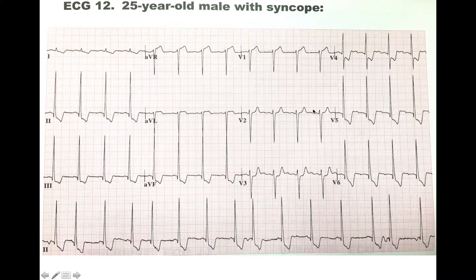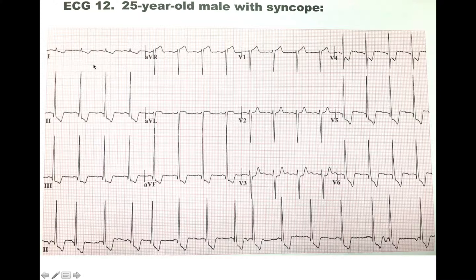So this EKG is leading us toward the idea that this patient has left ventricular hypertrophy. Another common finding in LVH is T wave inversions. Looking at lead 1 — it's a little more pronounced there — as well as in lead 2, you can see T wave inversions. That is a common finding in left ventricular hypertrophy.